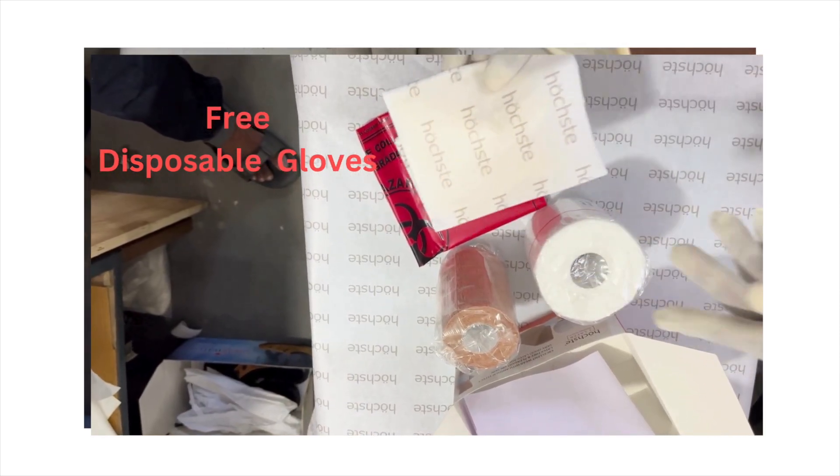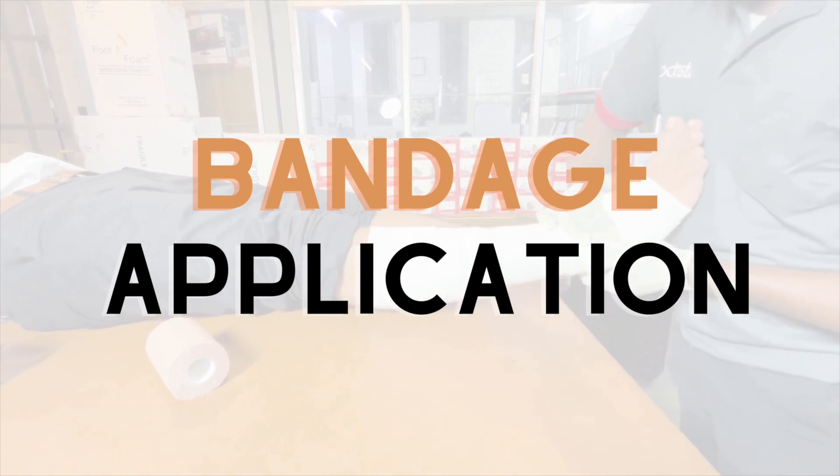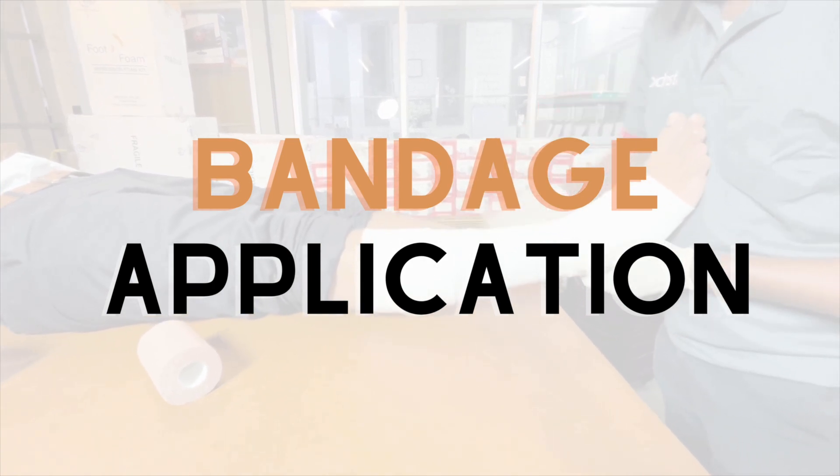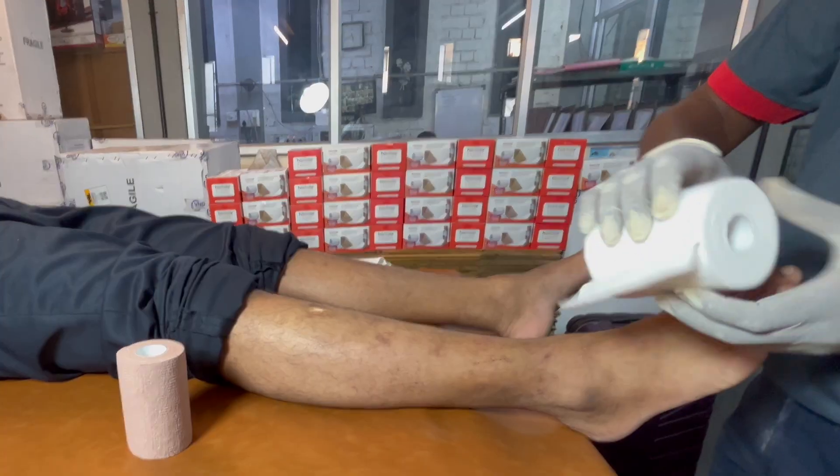And the free disposable gloves. Now let's learn how to apply the bandage. First, we should apply the white padding layer. Keep the ankle positioned at a right angle with toes up.